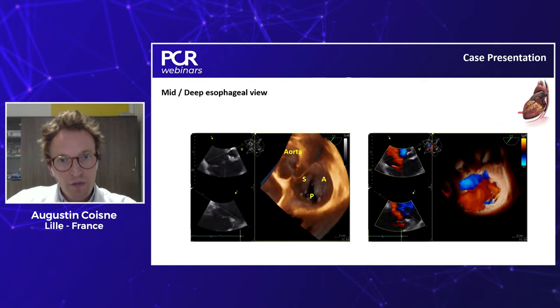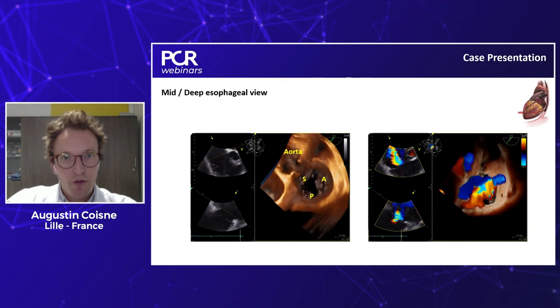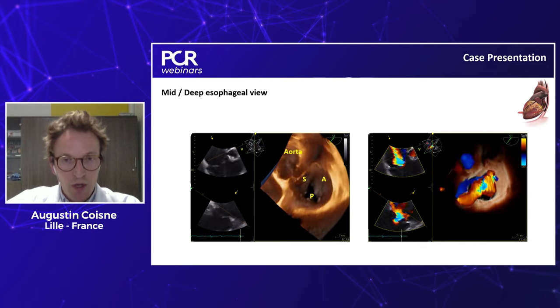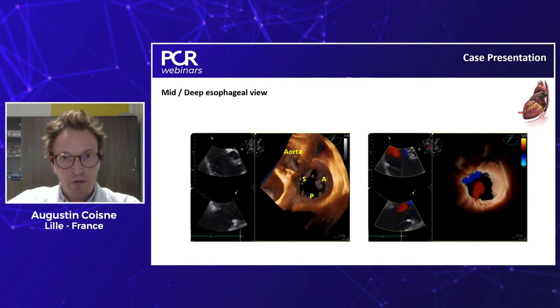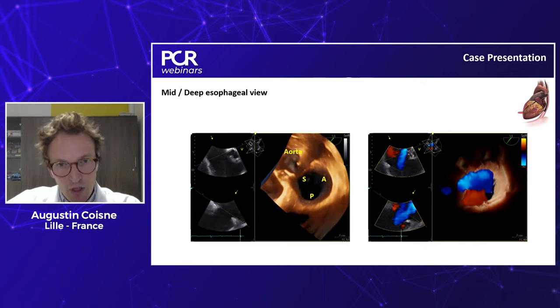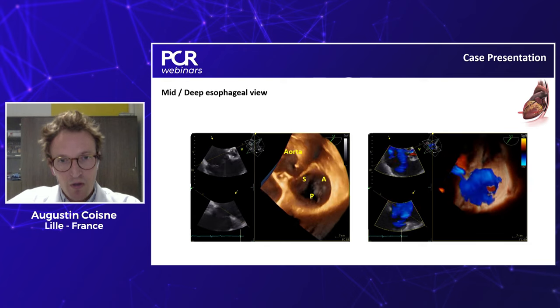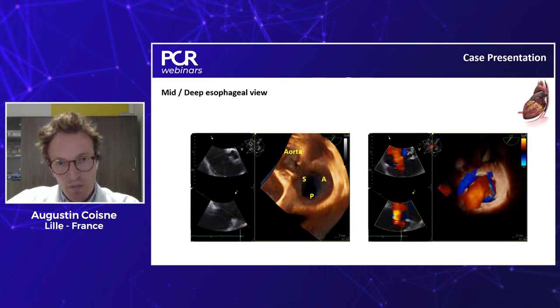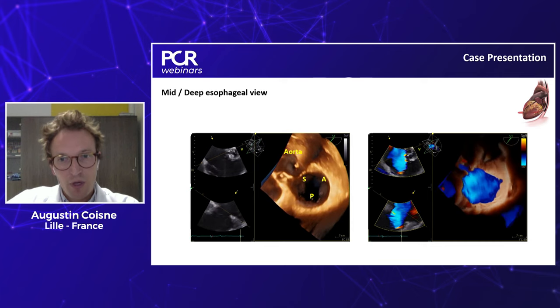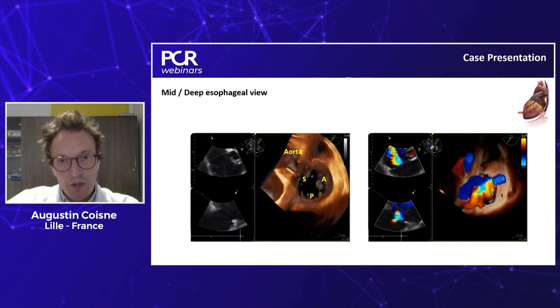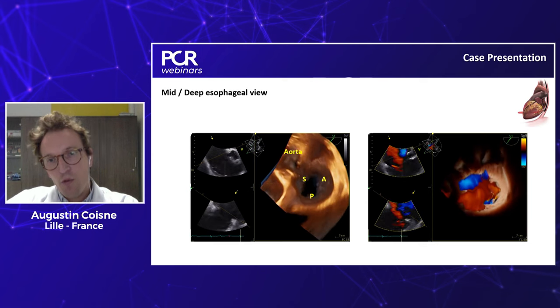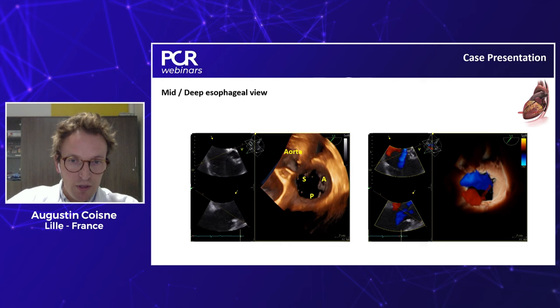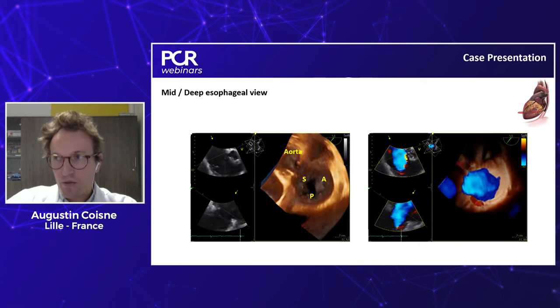From this view and also from the deep esophageal view, we performed 3D en face imaging from the right atrium with the aorta at 11 o'clock — showing the septal leaflet on the left, anterior leaflet on the right, and posterior leaflet below. We can see the gap between the septal and anterior leaflet clearly in 2D, 3D, and 3D with color and transillumination. Rotating the aorta clockwise to 5 o'clock gives exactly the same segmentation as the transgastric view: septal on right, anterior below, posterior on left.